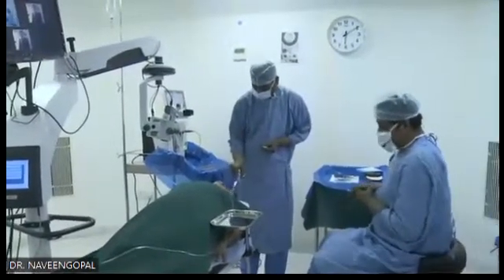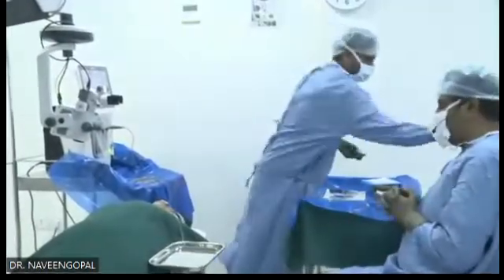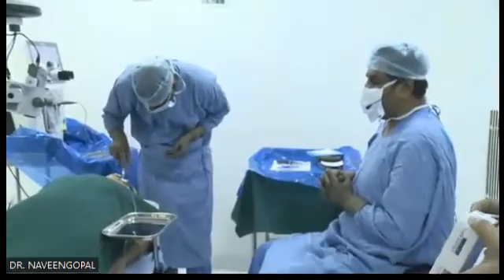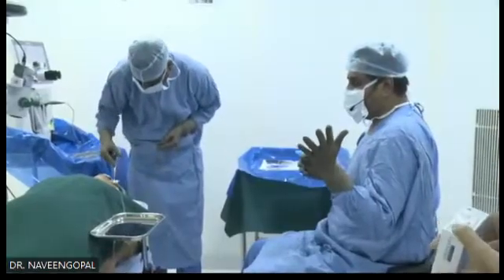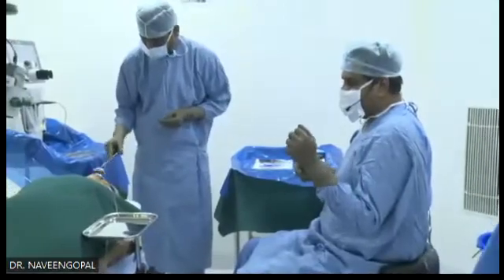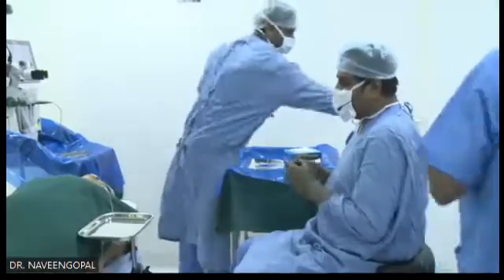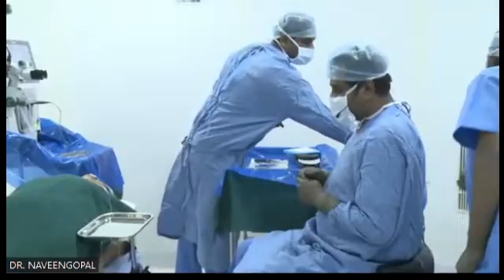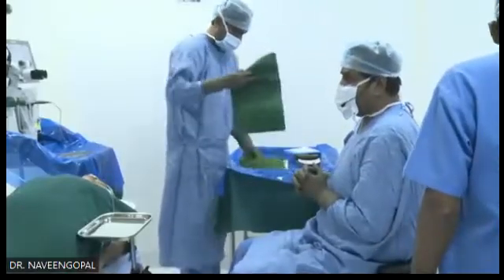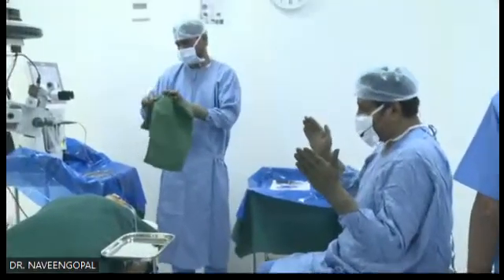This is a 65-year-old lady, hypermetropic. She wanted to get rid of glasses. See, for a surgeon, two challenges will be there: dealing with a very hard cataract or a very soft cataract. Lots of my hard cataract surgical videos are on YouTube. Here it's a very soft cataract, and I'll be telling you various techniques to take out a soft cataract. Both extremes are challenging, softest and hardest, grade 5 and grade 1.